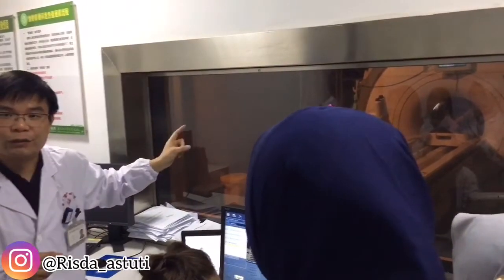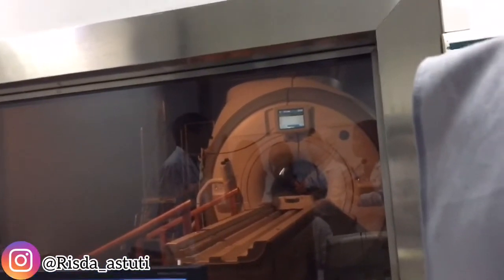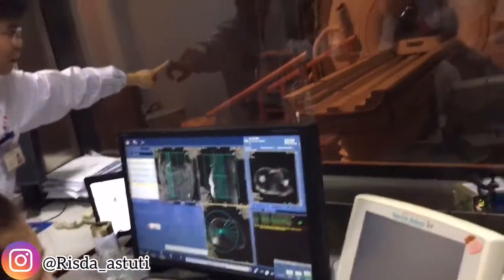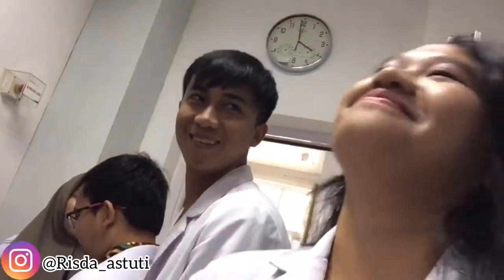Copper can interfere with the image. The copper screen has very little holes — if you look carefully there are many tiny holes — to give an electronic shield, an electromagnetic shield, to remove interference from other sources like cars or other wires.